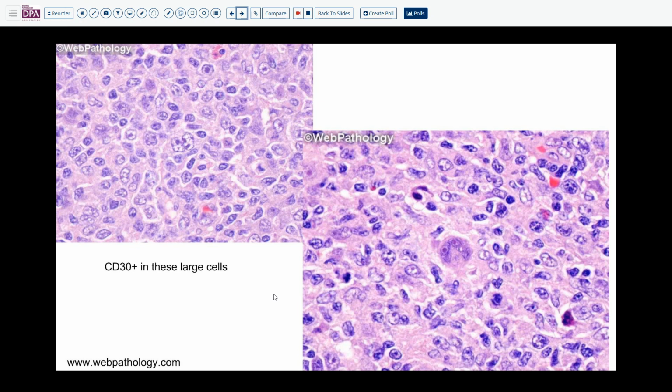Yes, this is exactly what it is. Especially for test purposes, in a really young patient, we have cells that really look like Reed-Sternberg cells. But you need to back up. Of course, I showed you this cell is CD30 positive. In this background, other than this cell, we have different kinds of cells like immunoblasts, and we also have some eosinophils, lymphocytes, plasma cells, and different cell types.